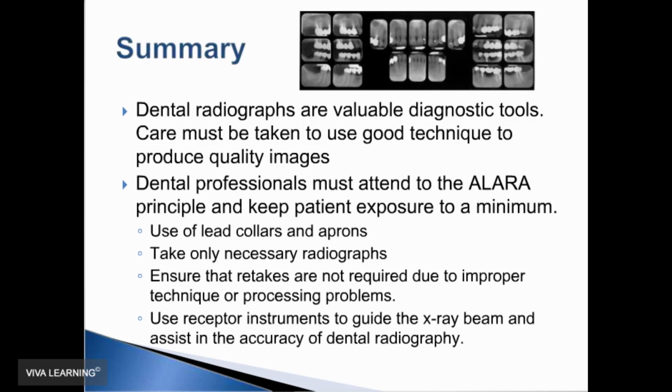We are the stewards of the patient's radiation dose when they're having images taken in dentistry. So it is our responsibility and ethical obligation to the patient to keep their dose as low as reasonably achievable. This is accomplished by providing lead shields, by only taking necessary radiographs according to selection criteria guidelines, and by avoiding technical errors that produce retakes, to keep the dose as low as possible.